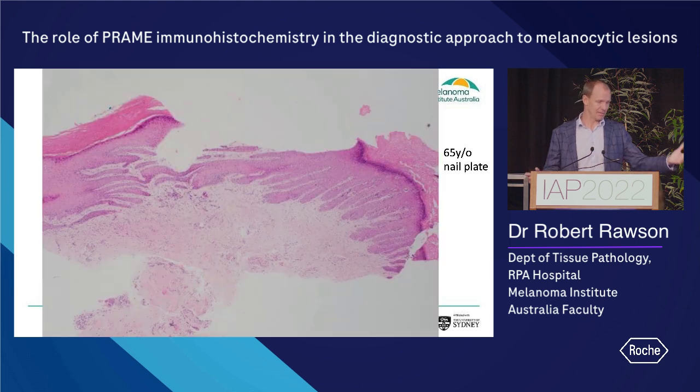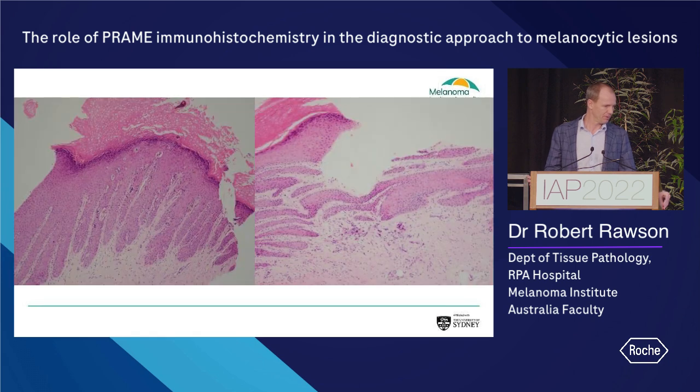And this is an example of a biopsy we got from the nail bed recently, and it was distorted and difficult to interpret. However, there were some concerning areas. On the left, there was this unusual junctional component, which was quite small, less than a millimetre across, with some nests and lentiginous cells with some upward spread and some atypia, but not much of a lymphocytic infiltrate below it. And this dermal component, which is about 2 millimetres away, was more hyperchromatic and epithelioid.